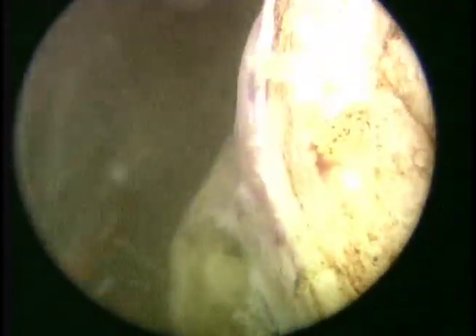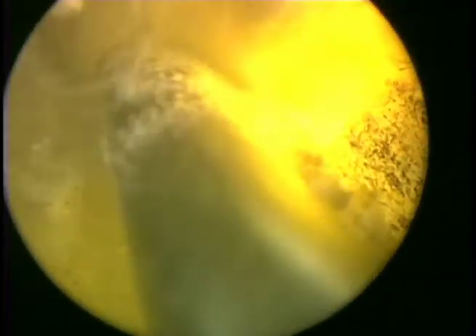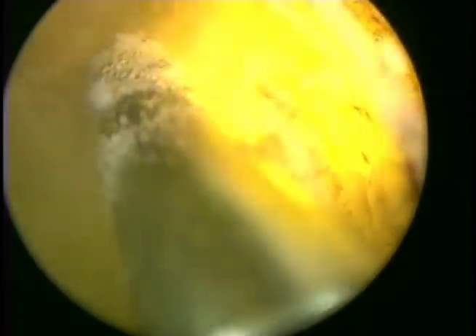Here we can see a good amount of tissue, so we will now use more of a slow sweeping rotation. Note the 30 degree, so 2 hours on a clock, rotation of the fiber, slowly drawing back toward the verumontanum. Occasionally we will get some fiber lift due to those small stones, and simply working around them is all that is required.